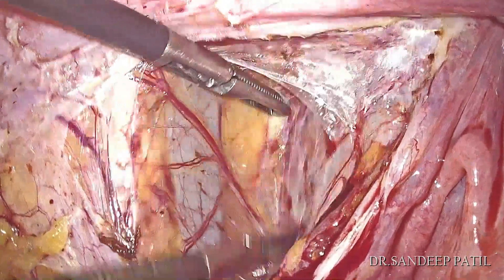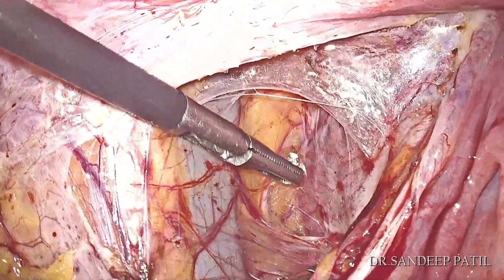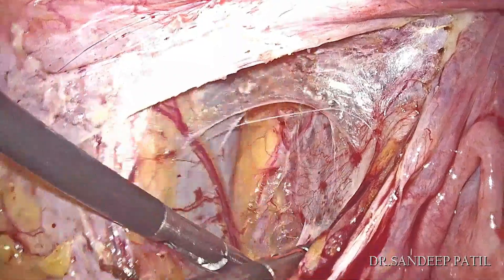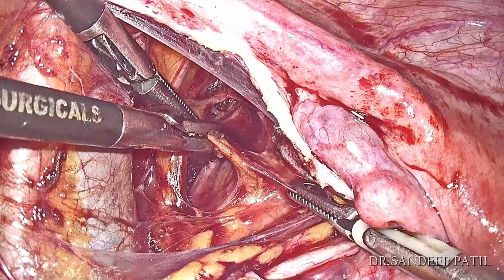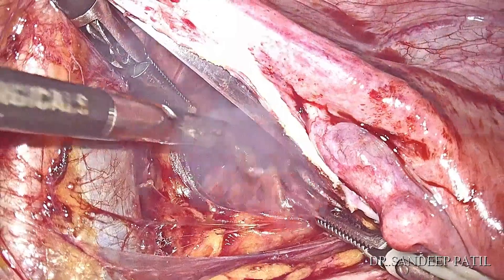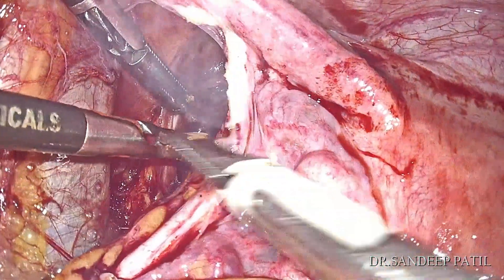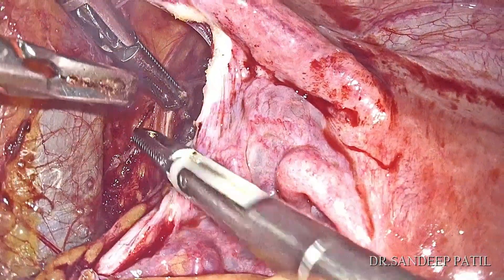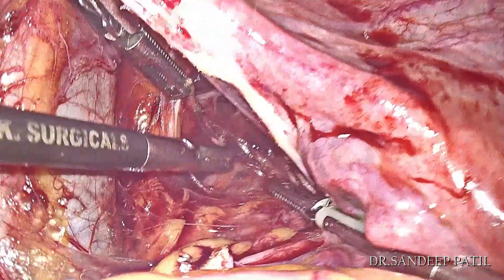The surgery typically began with mobilization of sigmoid colon followed by uterine artery temporary ligation at its origin. By doing this we reduce the blood supply to the uterus and the fibroid.